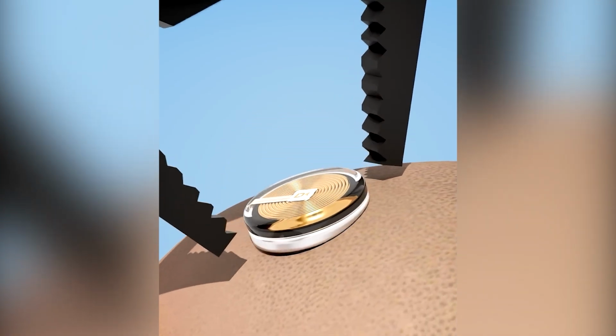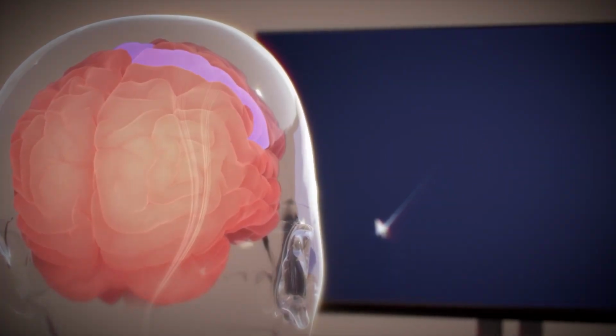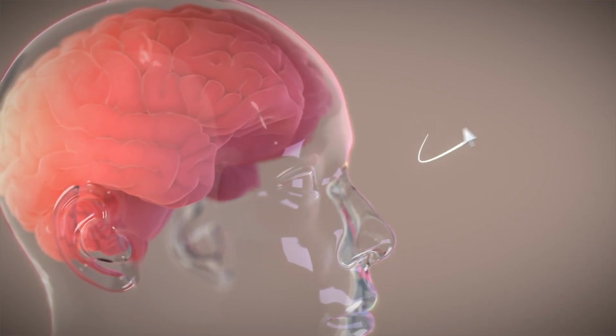And when you want to move your hand, that doesn't happen in some random place in the brain, but in specific areas. That's where the threads are placed, and the threads pick up that signal that you want to move your hand left or right, and the cursor moves accordingly. This is not eye tracking. This is literally, in the most direct sense, mind control.